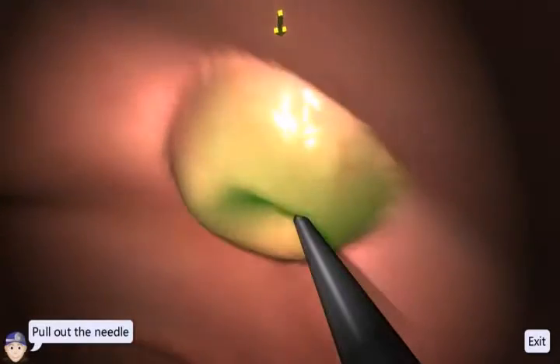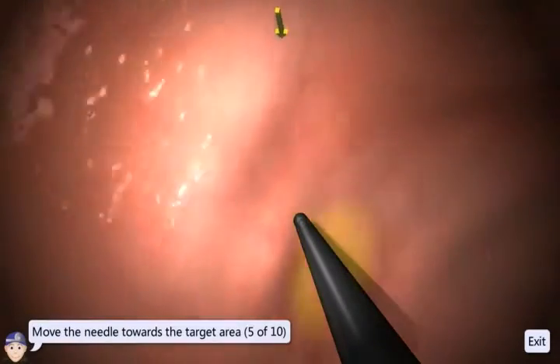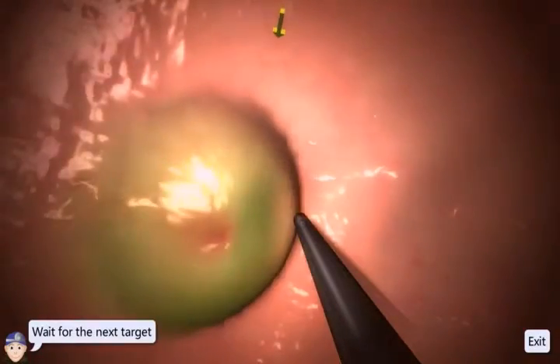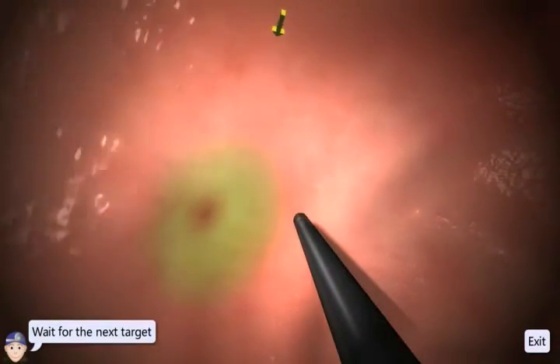When removing the instrument from the tissue, be sure to pull the needle straight out, as scratching the tissue will cause damage to it and negatively impact your results.